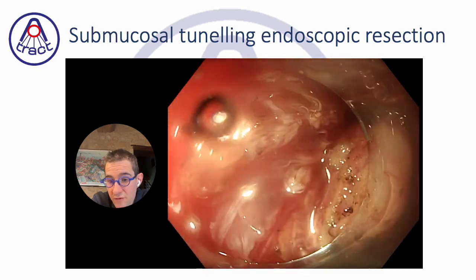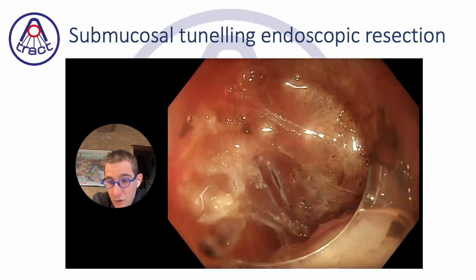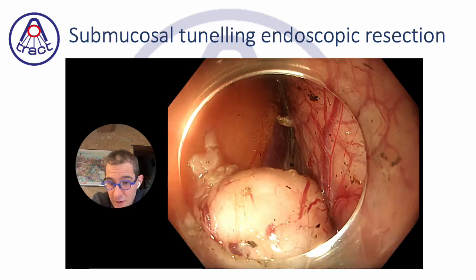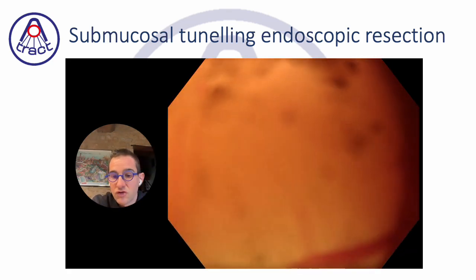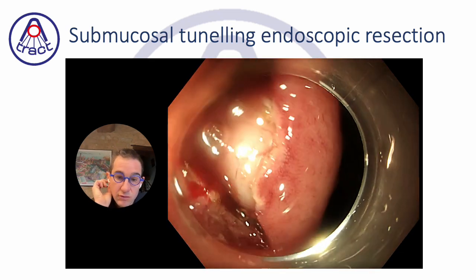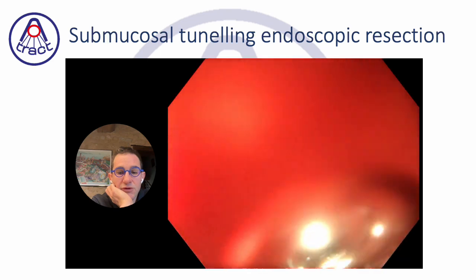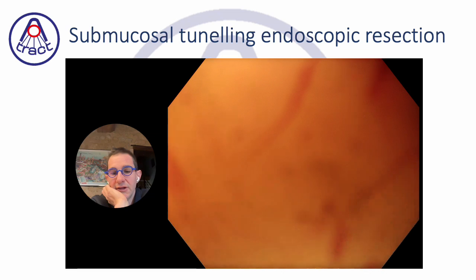I went to control if there is any adherence. I forgot because I was a little surprised that I couldn't get it outside, but in fact, it is free, completely free. There is no more adherence, but every time there was an angle at the entrance of the channel, which makes the extraction, the retrieval of the lesion difficult. So you will see the longest or the most difficult part of the procedure was here, and it takes at least 2 or 3 minutes to get it outside the channel.